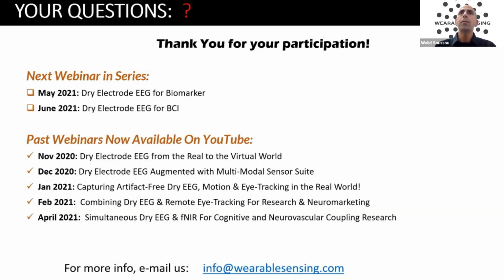We do see at the very low frequencies, you start to see an increase in noise in the dry electrodes. We tend to see that that's within the variance. Sometimes you'll have the dry electrodes be slightly noisier. Sometimes you'll see the wet electrodes be slightly noisier. On average, the dry electrodes are slightly noisier, but it's not statistically significant, so it's well within the variance. Certainly between 0.1 and above, we're quite comparable to what the wet signals are getting.